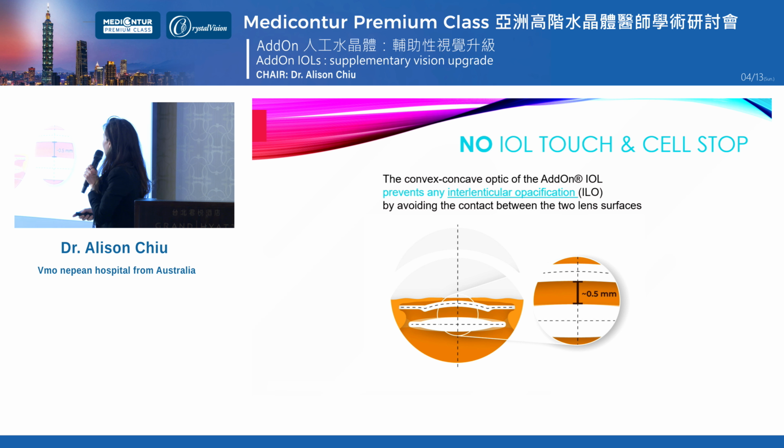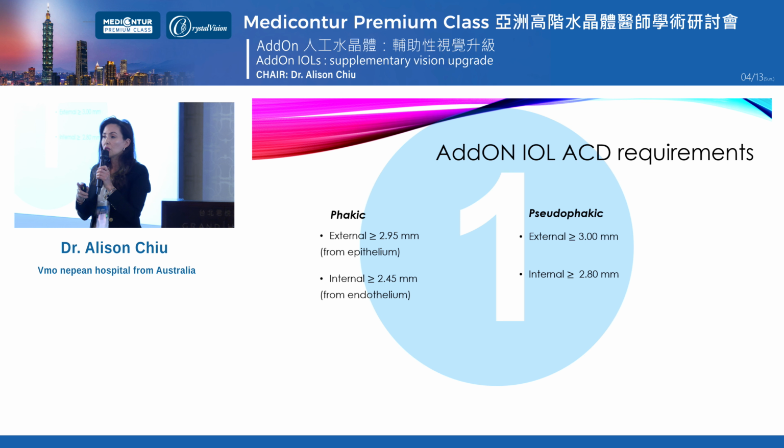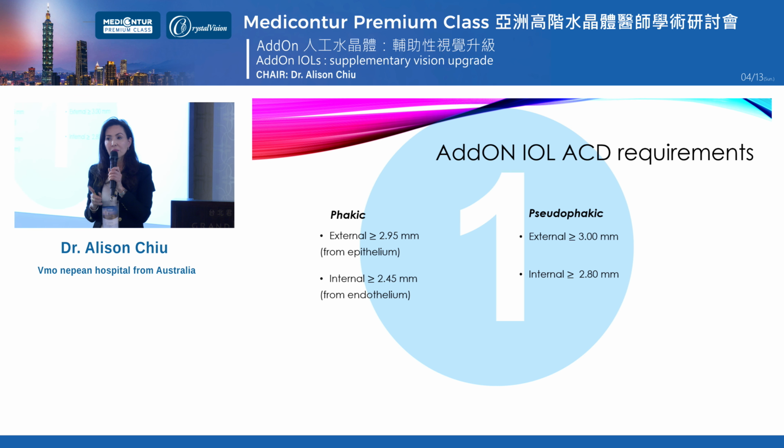We don't have to worry about it because there's no contact between the lenticular surfaces, and that's even in cases of high-powered monofocal IOLs where we're up to 30 diopters and upwards. You just don't see the contact, but you do need to have sufficient anterior chamber depth to implant this lens.